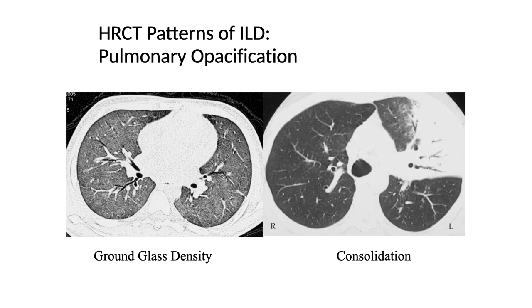On the right side of the image we see total solidification with air bronchogram — that is consolidation — complete consolidation. On the left side upper part there are ground glass opacities adjacent to the consolidation. This is the difference between ground glass density and consolidation. An X-ray and CT scan taken one hour apart: the X-ray is completely clear and normal, however the CT scan clearly shows ground glass opacities in the right basal lobe.